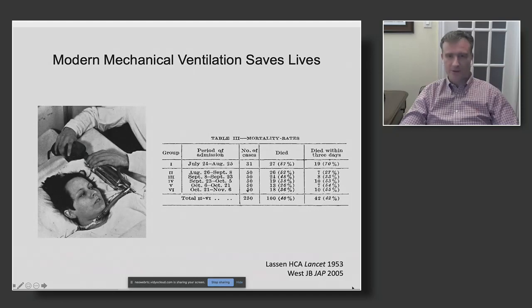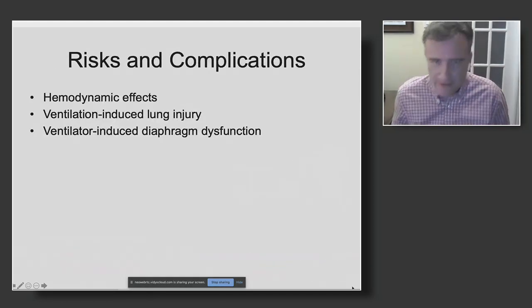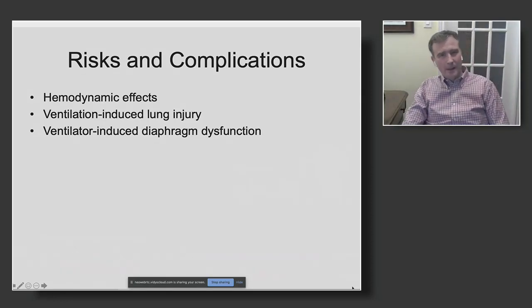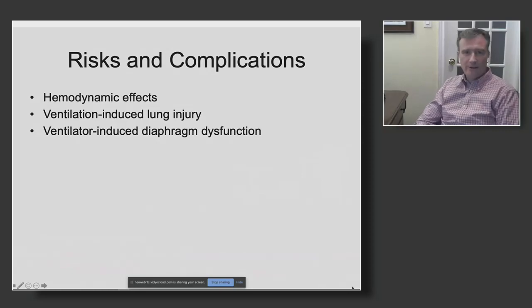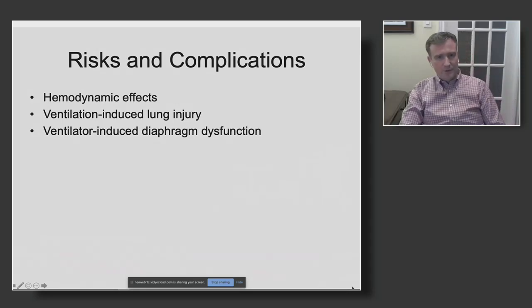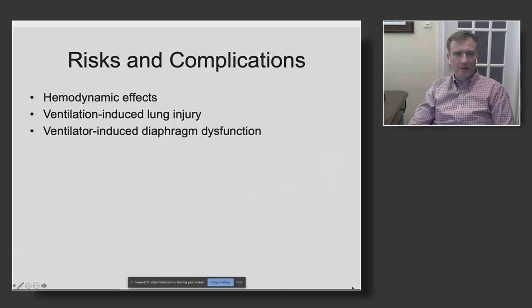There's no question that ventilation saves lives. But like anything we do in medicine, along with the good comes potential harm. And so this talk is basically designed to introduce you to the issue of risks and complications attached to mechanical ventilation. So when you're at the bedside, assessing the patient and thinking about the ventilator settings that you're applying, we want you to take into consideration several important potential complications.